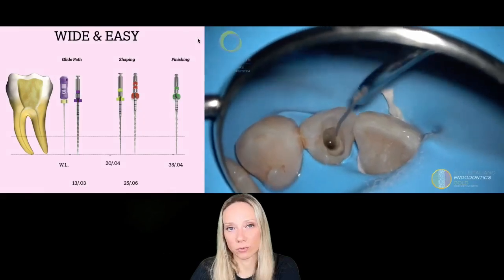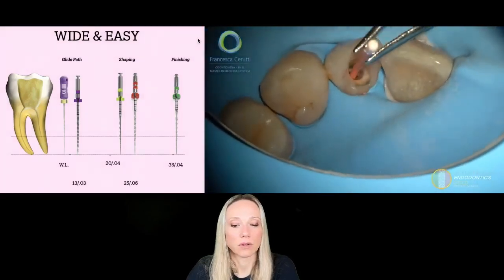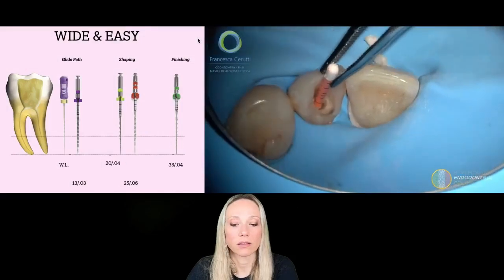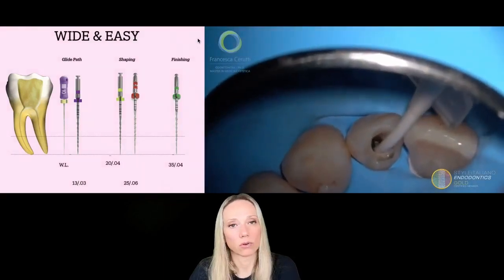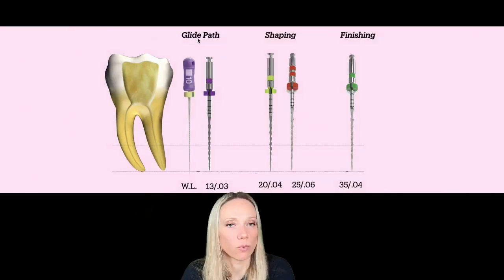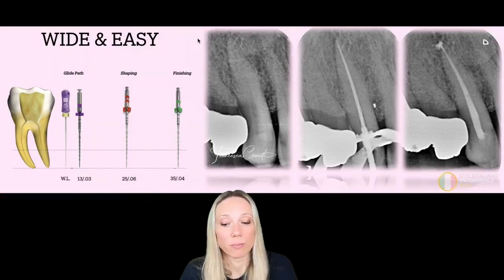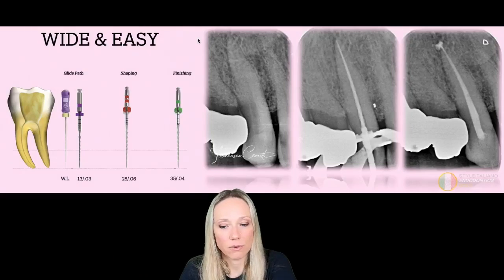I do all my irrigation procedure that we are going to see in the next webinar. I activate the irrigant, and then I just do my apical gauging. That was even more, and I choose the correct gutta-percha cone for this tooth. And then I go and do my filling procedure. So this is the sequence that we are going to use in wide and straight canals. All the instruments of the sequence taken straight to the working length. And we will see there is no problem. Also in this canine, for example, I use the same approach. And the only difficulty is the canine is longer, so maybe you need longer instruments. But otherwise, there is no difficulty.